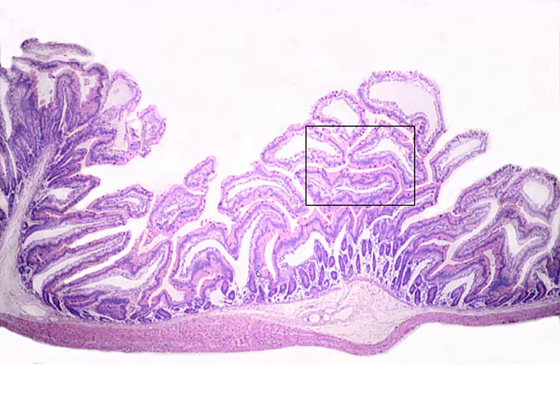So here's a closer magnification view, again showing the villi. Here we have a plicae circularis, and all of these big open spaces here, these are going to be our central lacteals in the middle of our intestinal villi.